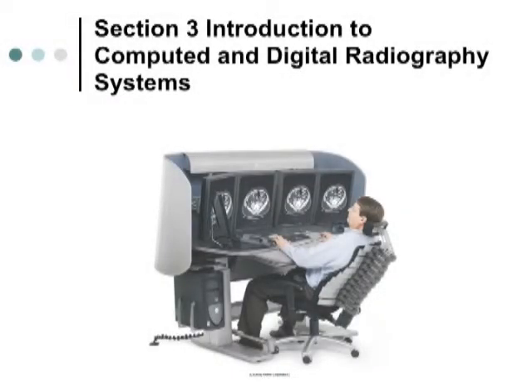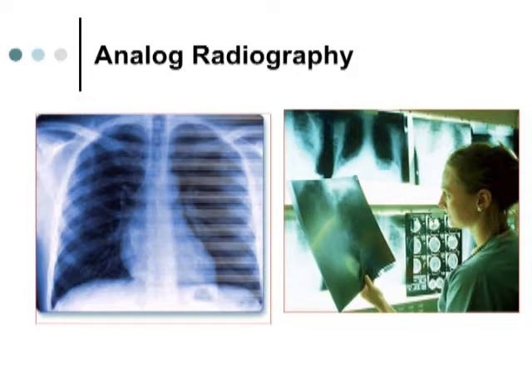When we talk about conventional radiography, also known as analog radiology, this is what most of us grew up with: a film-based system, where we would take an X-ray using film. And when they first started with X-rays, they used glass plates. You've all heard the term flat plate. Let's take a flat plate. Flat plate was a term that came from glass plates that were painted with emulsion. And those were used up until World War I.